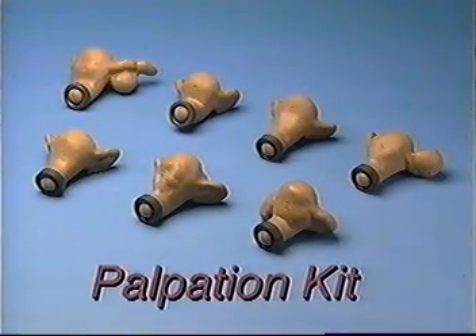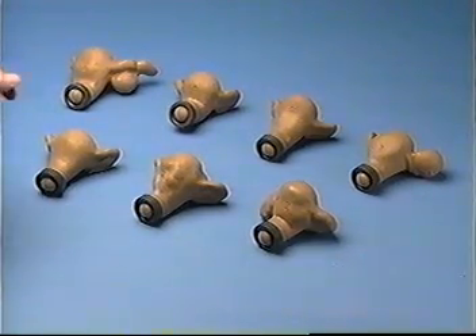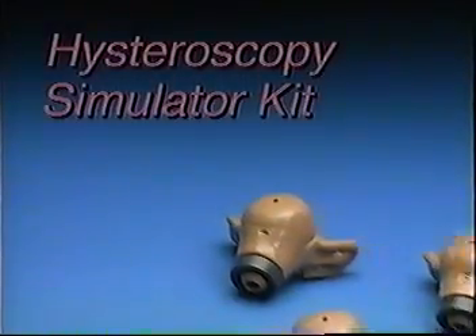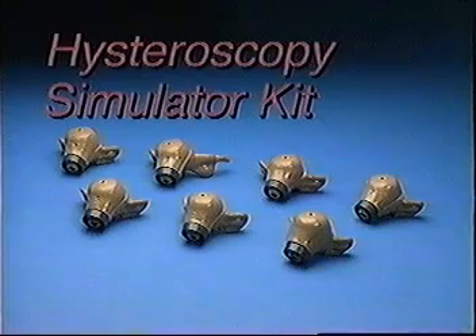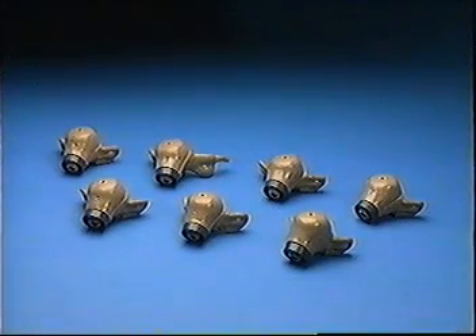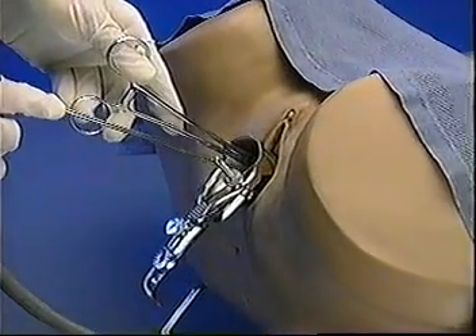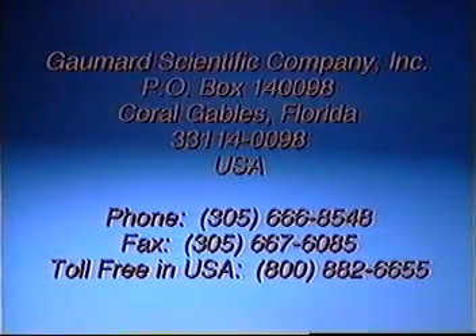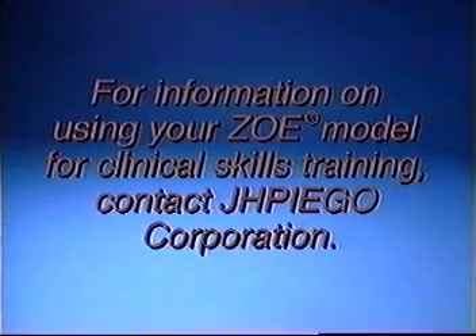Another kit available is the palpation kit. This contains one normal non-pregnant uterus and six uteri with externally palpable pathologies. Finally, there's the hysteroscopy simulator kit. This kit contains one normal non-pregnant uterus and six uteri with internal pathologies. These pathologies can be viewed through the hysteroscope. If you would like more information on your ZOE gynecologic simulator and the kits which expand its use, contact Gaumard Scientific Company. For information on using your ZOE model for clinical skills training, contact JHPIEGO Corporation.